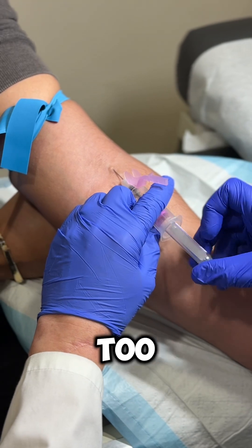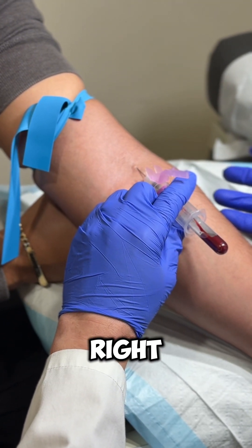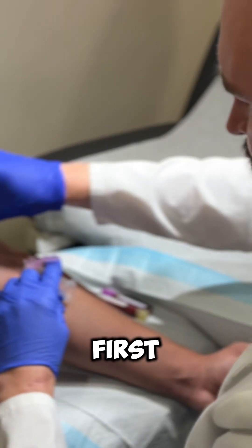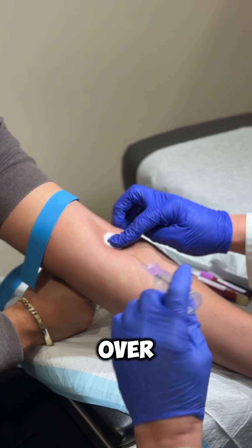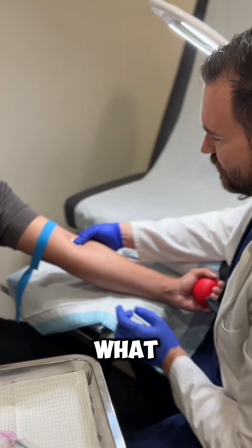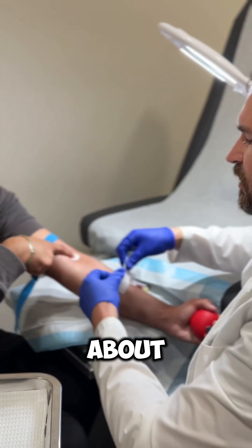See how perfectly it flows. Another misconception I see a lot — people take the needle out first, then get the cotton ball and roll it over. I don't like telling people to bend the arm because it's going to cause more bruising. What I tell patients is just keep the pressure on here — hold it, put a little gauze on top, and take it off in about five minutes. That's it.